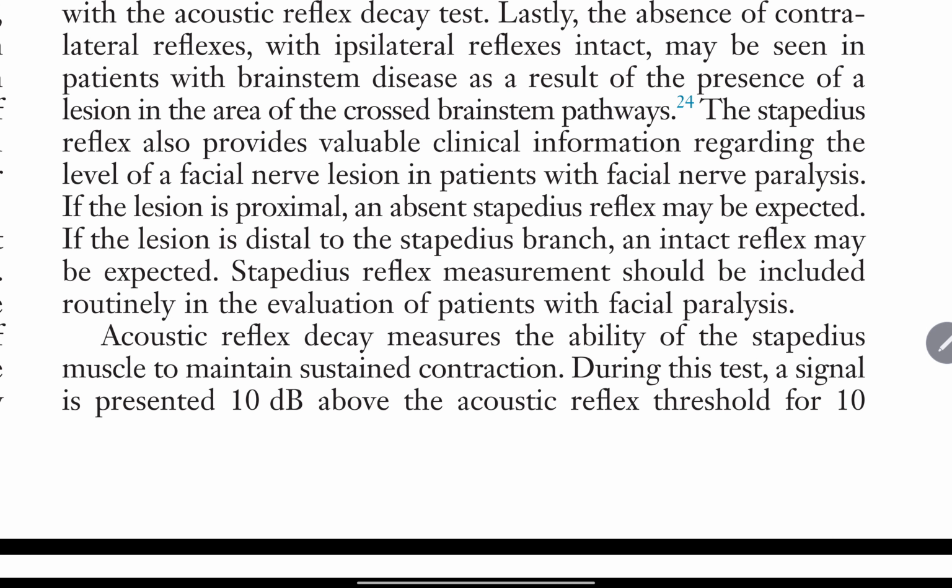The stapedius reflex also provides valuable clinical information regarding the level of facial nerve lesion in patients with facial nerve paralysis. If the lesion is proximal, an absent stapedial reflex may be expected. If the lesion is distal to the stapedial branch, an intact reflex may be expected. Stapedius reflex measurement should be included routinely in the evaluation of patients with facial nerve paralysis.